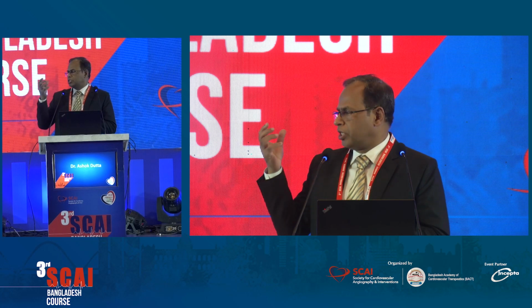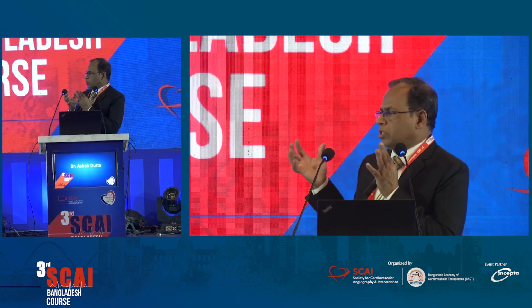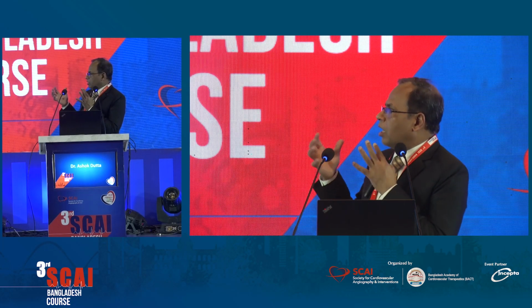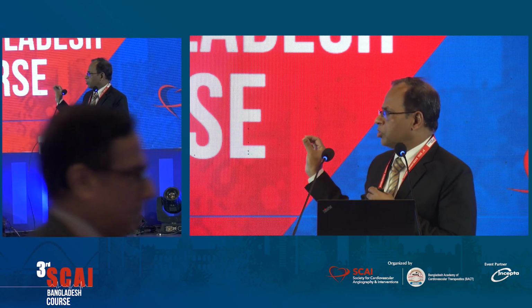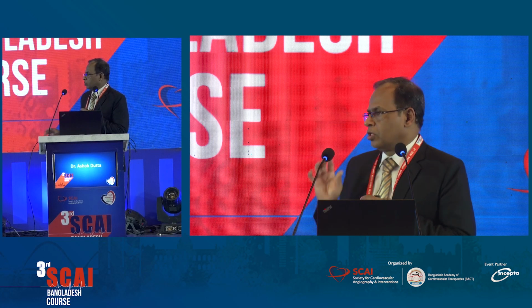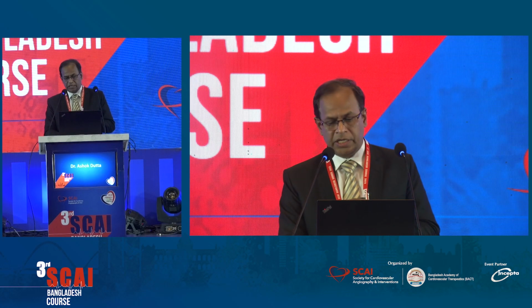Even then, if it is a 3 millimeter stent, the balloon will inflate up to 3 millimeter. So the stent is almost inflated. So it is difficult to retrieve, difficult to push it inside also. So better to take a 1.5 or 2 millimeter balloon, as I did here.